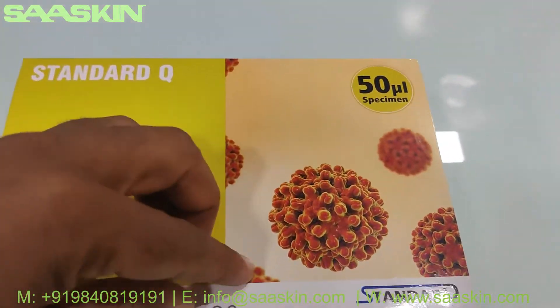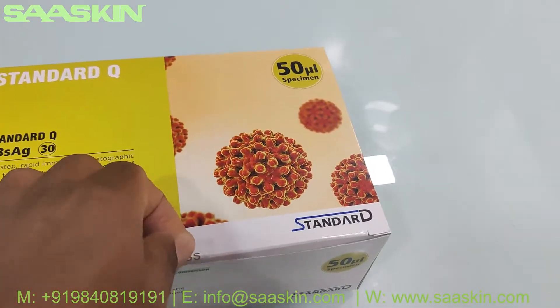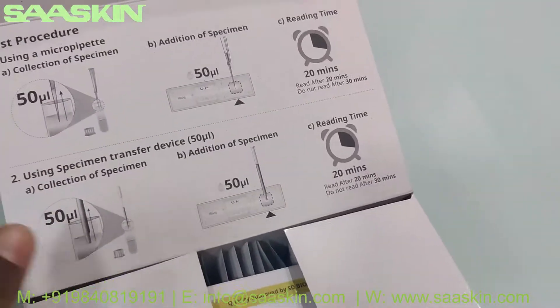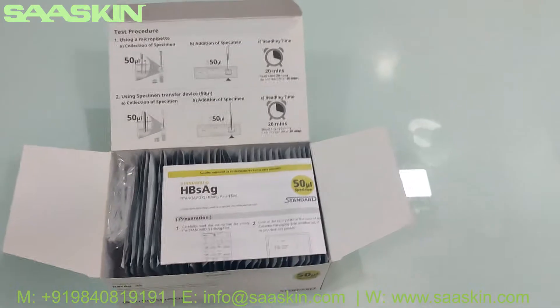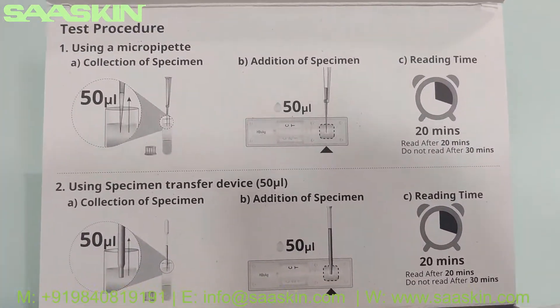Okay, let me unbox this. When you open the box, this is what the inside looks like. You can see the test procedures printed inside the box.